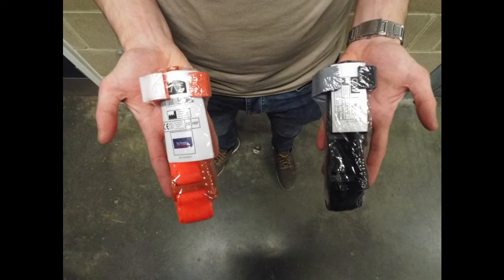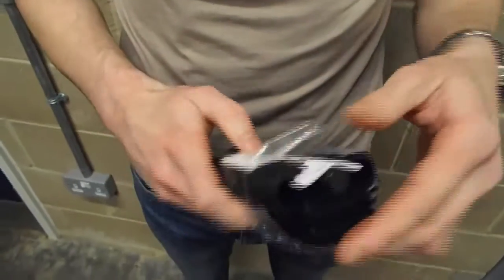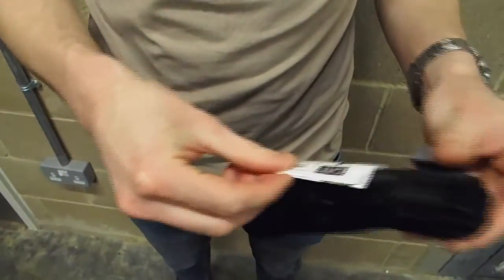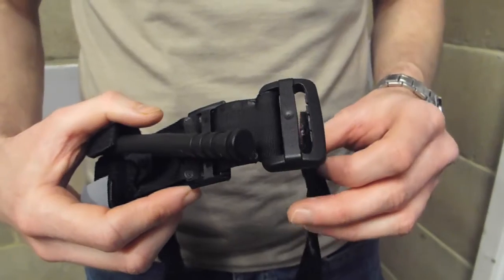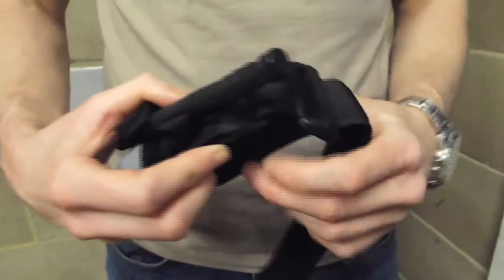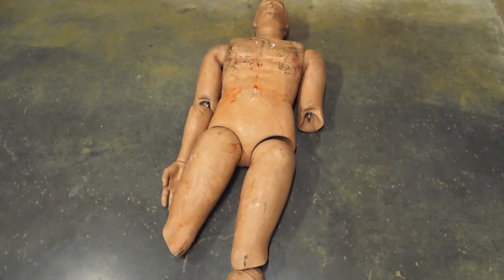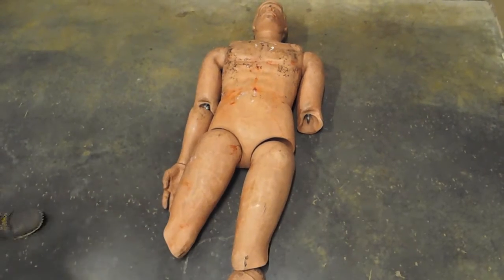The CAT comes in black or orange and is packaged in a thin plastic wrapping. It is made up of a velcro strap, a buckle, and a windlass. When the velcro strap is fastened around the casualty's limb, the windlass can be turned, making the CAT very tight very quickly. This restricts arterial blood flow through the limb and is often referred to as turning off the tap to a massive bleed.